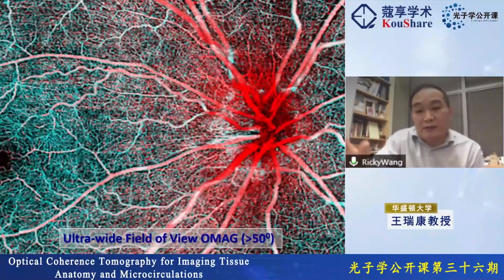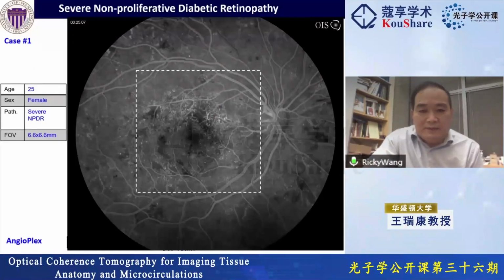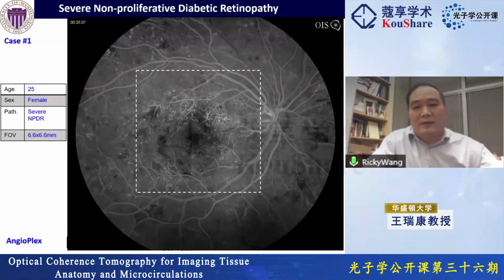Okay, so this is the beauty of the OCT, because it has high resolution and is non-invasive. You can image the patient without any contact, right? So that's the beauty. Okay, so let's look at a couple of examples very quickly of looking at patients.